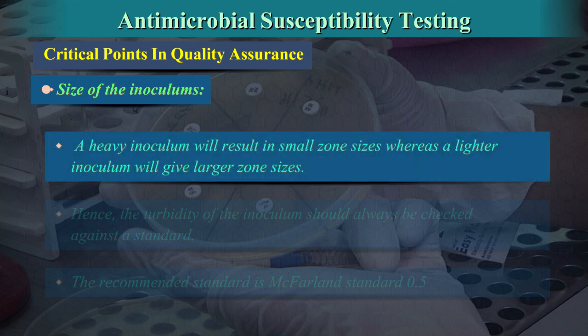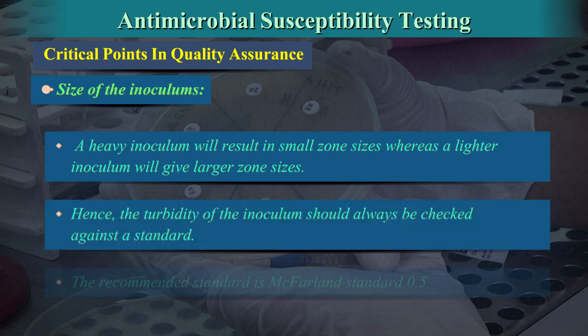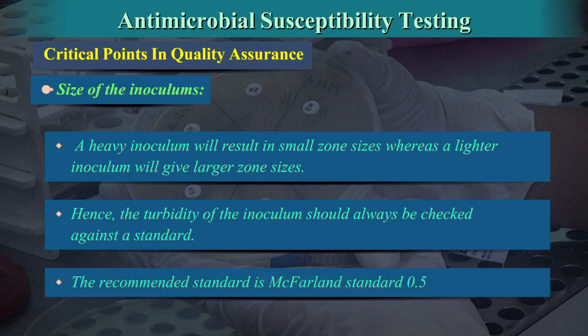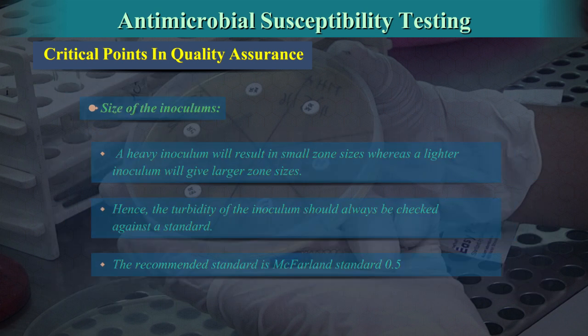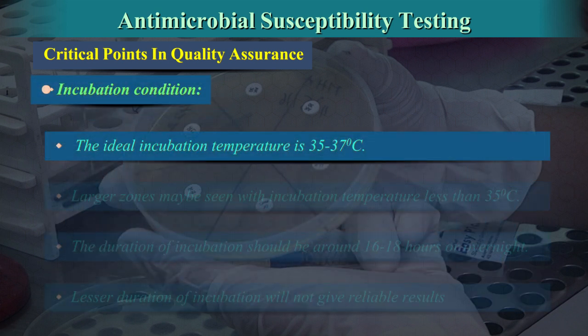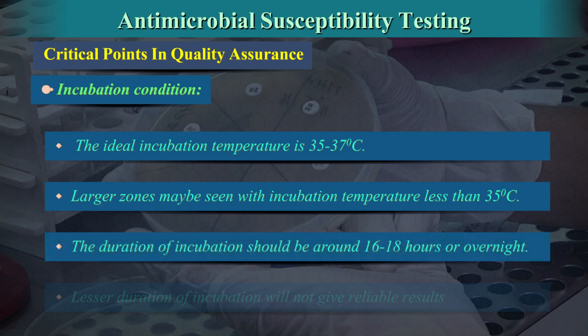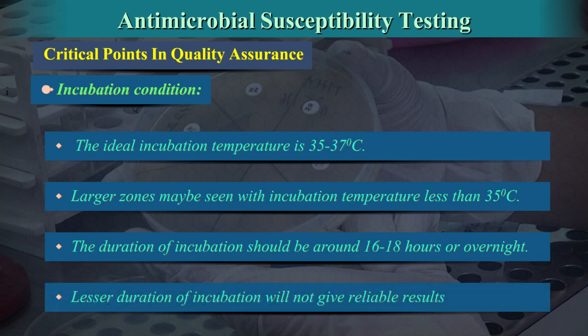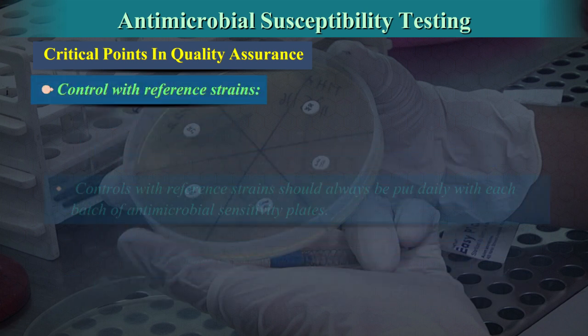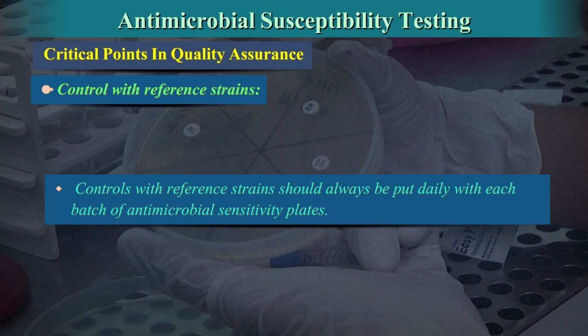Size of the inoculum: A heavy inoculum will result in small zone sizes, whereas a lighter inoculum will give larger zone sizes. Hence, the turbidity of the inoculum should always be checked against a standard; the recommended standard is the 0.5 McFarland standard. Incubation condition: The ideal incubation temperature is 35 to 37 degrees centigrade. Larger zones may be seen with incubation temperatures less than 35 degrees centigrade. The duration of incubation should be around 16 to 18 hours or overnight; lesser duration will not give reliable results. Controls with reference ATCC strains should always be run daily with each batch of antimicrobial sensitivity plates.